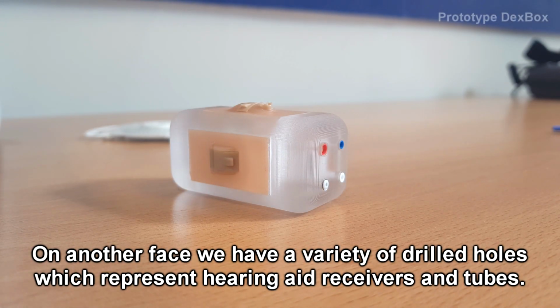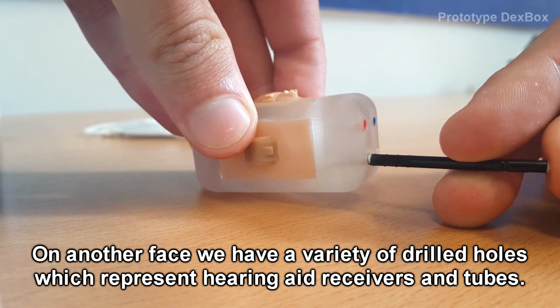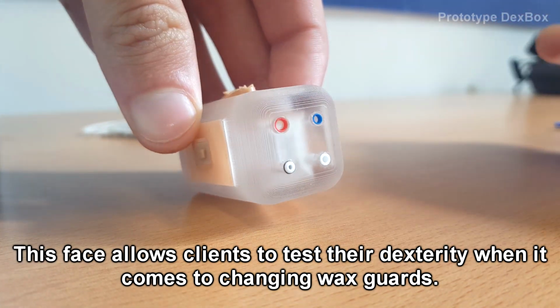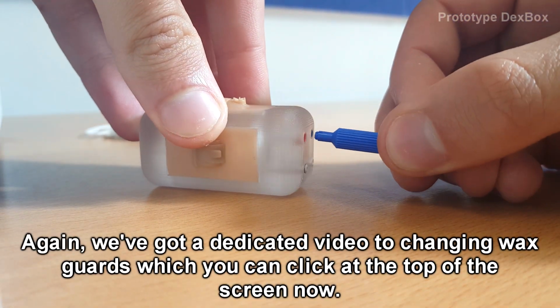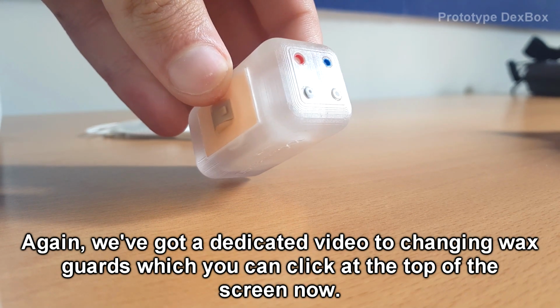On another face, we have a variety of drilled holes which represent hearing aid receivers and tubes. This face allows clients to test their dexterity when it comes to changing wax guards, as wax guards can often be quite small and tedious. Again, we've got a dedicated video to changing wax guards, which you can click at the top of the screen now.